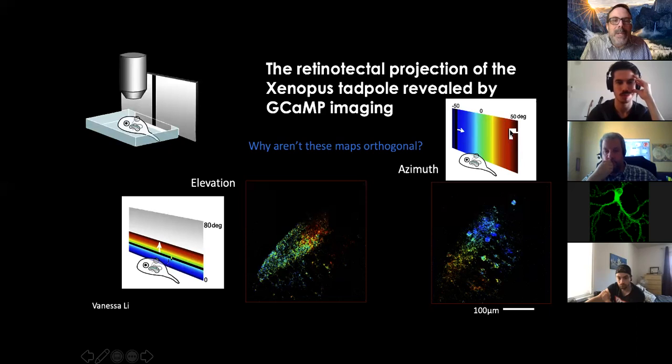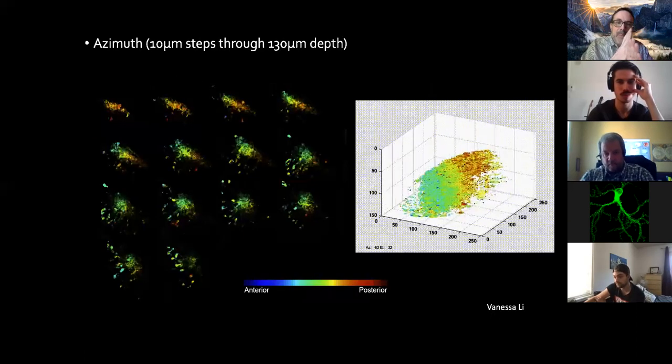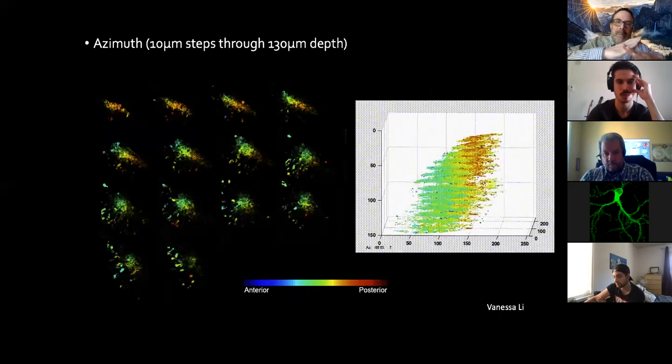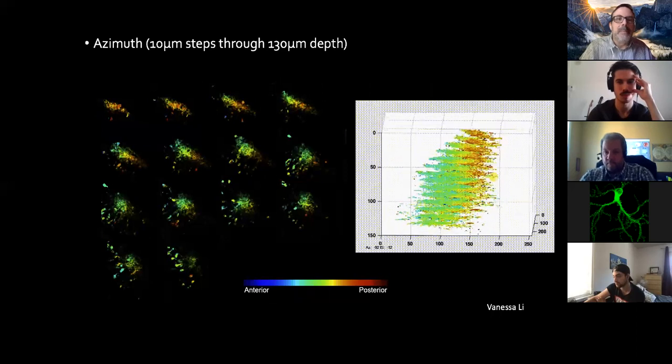The orientation of these maps is not orthogonal. I sort of was expecting that they would be perfectly orthogonal to one another, but we found that if we image the same animal over time, and I don't have this data to show you, the maps actually become increasingly orthogonal over time as the map develops. So that may be one of the properties that emerges with development.